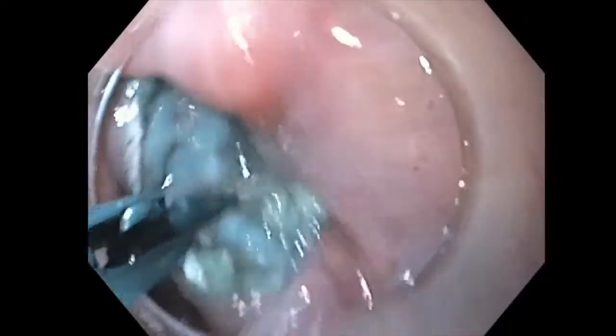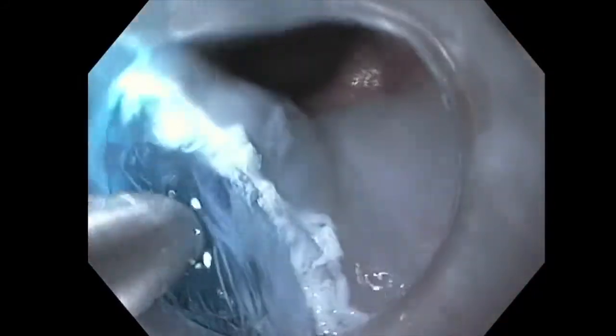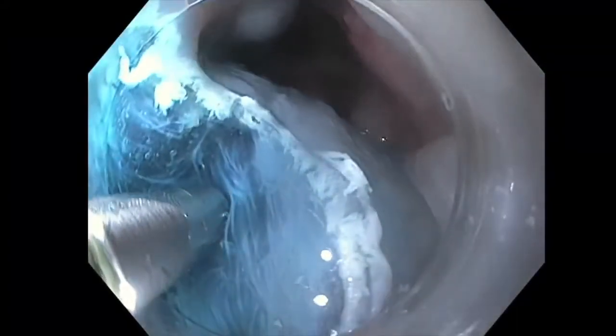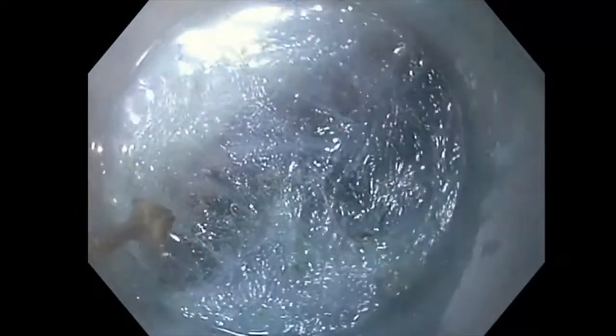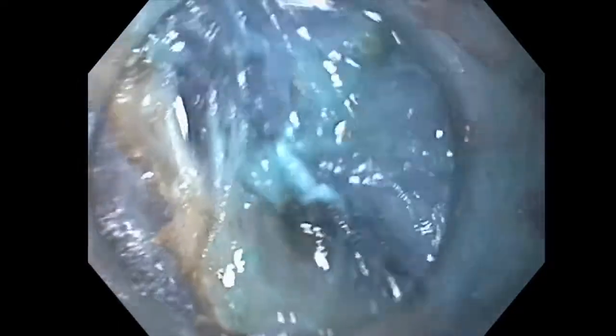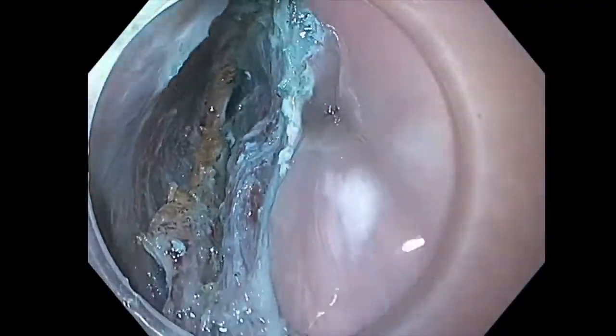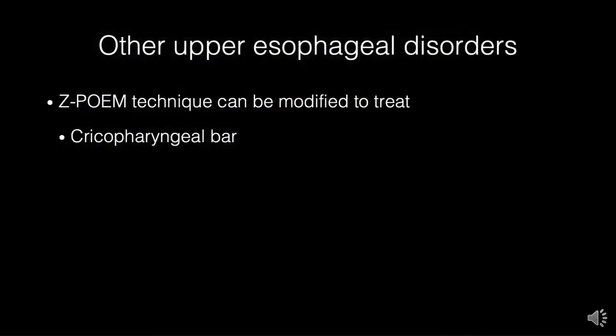After the initial incision, fibrotic tissue can be clearly seen. Septotomy is continued sequentially until submucosal tissue is eventually visualized. Injection of the premixed solution into this tissue is then able to delineate the submucosal plane, allowing the completion of a submucosal tunnel. The benefit of this procedure over standard septotomy is that tunneling can be performed at the crucial point, the base of the diverticulum, to allow direct visualization and confirmation of a complete myotomy, thereby again theoretically reducing the risk of recurrence.